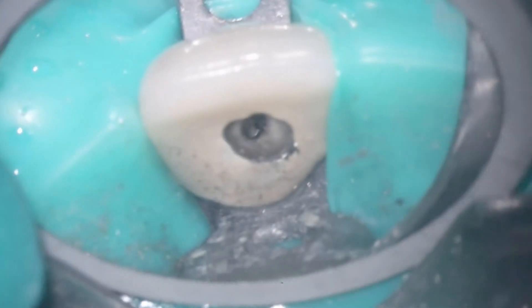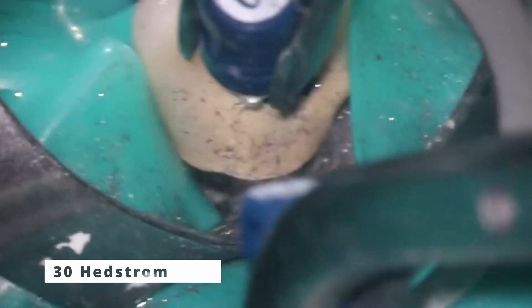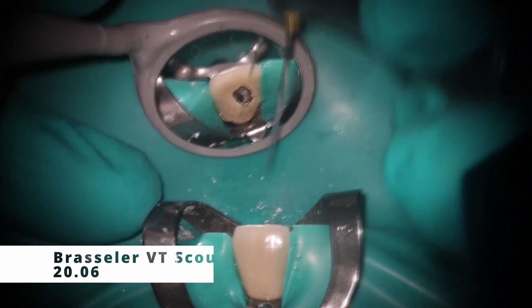So here's what we do. First thing you're going to need is some form of a hedström file — you want one that's a little bit smaller than the size of the canal. This was a large open anterior. So using that size 30 hedström with end-file forceps, you go back and do an up-and-down motion — not really rotating it at all. What I'm trying to do is file it, and you can see chunks of the pulp stone are coming out. Remember, hedströms work in a pull motion, so by pulling up you're almost sanding it down flat.